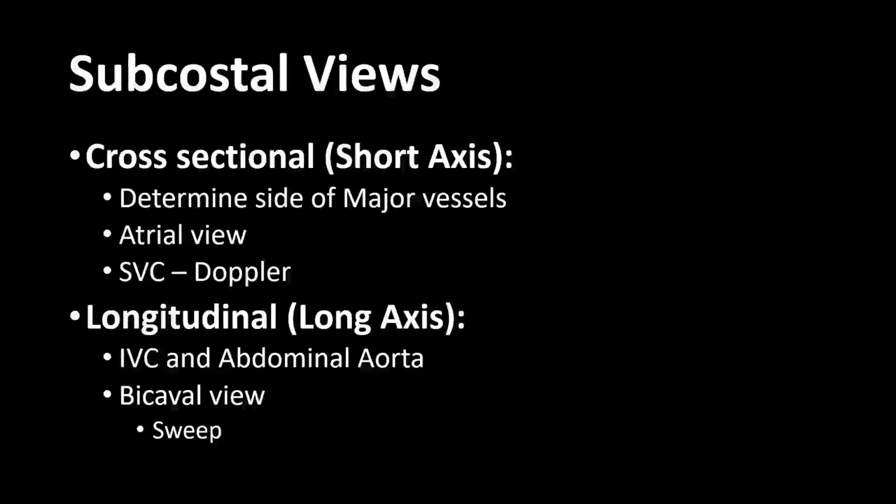So we have discussed 4 high parasternal views. One is the arch view, which is to be done from the right subclavicular area, pointer pointing at 12 to 1 o'clock position. You see the arch with 3 branches. And then 3 views we did from the left subclavicular area. One is the ductal view, where the probe is kept in the left subclavicular area, pointer pointing at 12 to 1 o'clock position. Then we have the pulmonary artery view. Again, it is from the left subclavicular area, but here the probe pointer is pointing at 3 o'clock. You see pulmonary artery, aorta, and SVC.